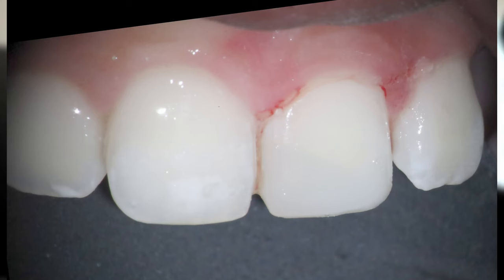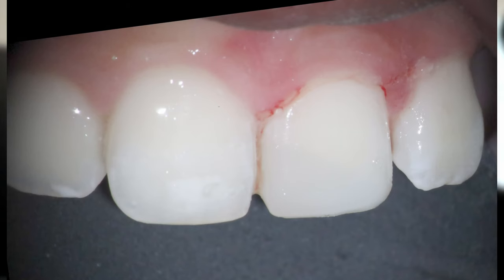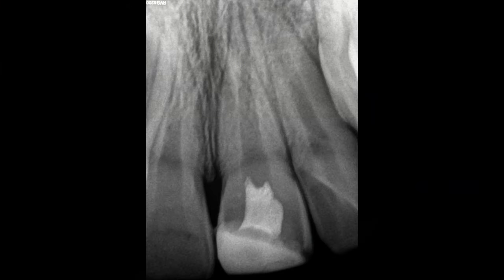You can see aesthetically, it looks good. I did shorten the incisal ledge a little bit from where this final photo is. But from the before and after, really pleased with that. And really happy with how this x-ray turned out as well. You can see just how nice and thick that area of BC putty is, and that's what we're going for here. So anyway, I thought this was kind of a fun one, especially because I don't normally have fillings break like this, but I think that was entirely my fault with the bonding agents, as I just mentioned.